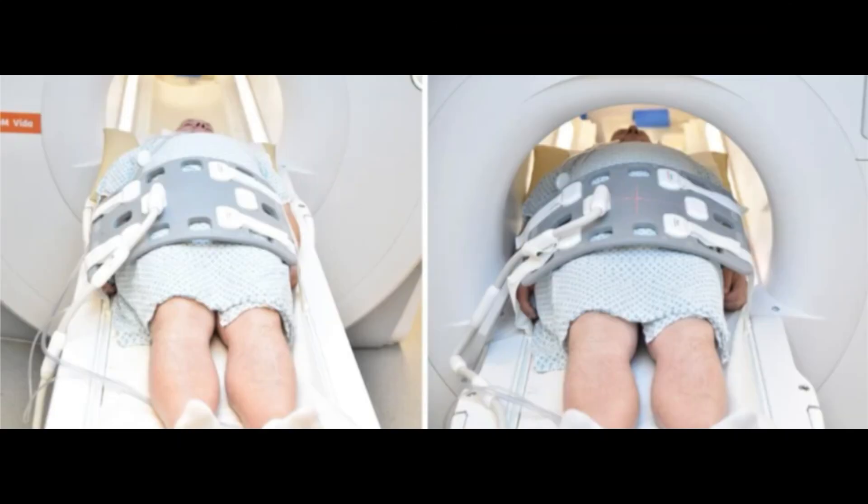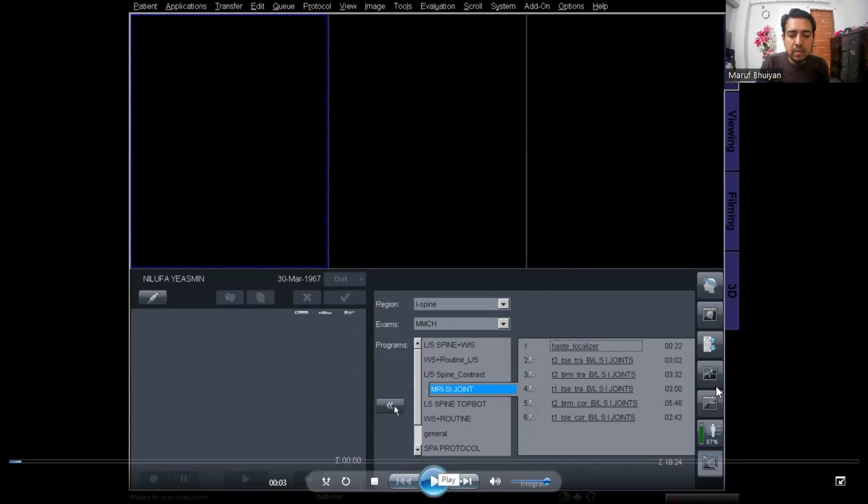First, start with the patient positioning. Position the patient in supine position, head pointing towards the magnet. Position the patient over the spine coil and place the body coil over the pelvis. The coil's upper region should be 3 inches above the iliac crest and the lower border should be on the symphysis pubis. Center the laser beam 2 inches below the iliac crest. Now go to the monitor and start the MRI.